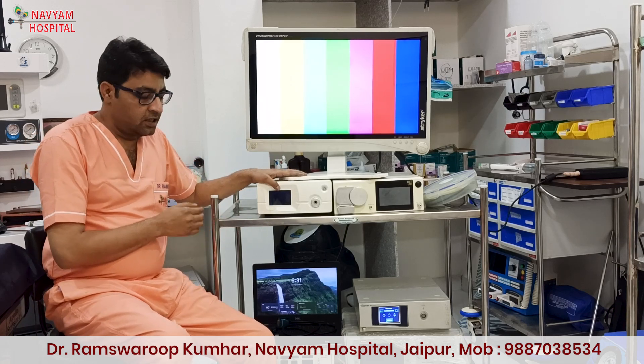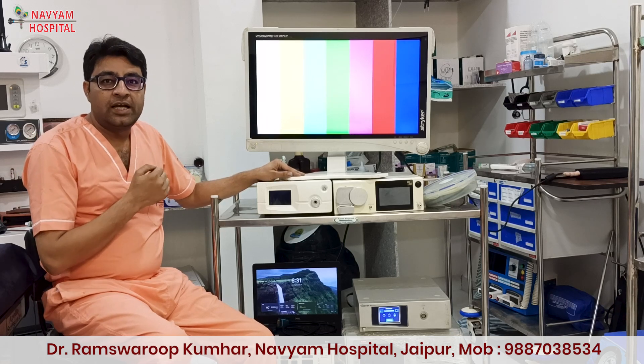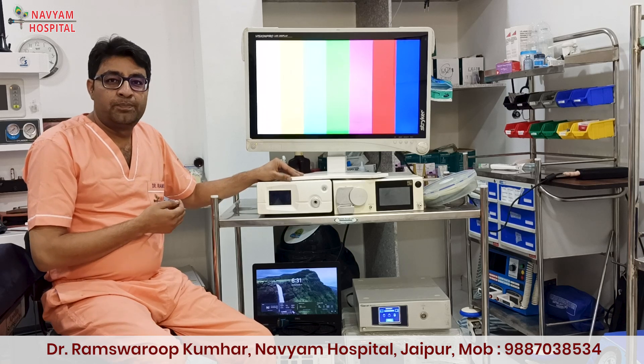So this is the basic setup. You can start with 10 lakh rupees, and you can upgrade according to time, your expertise, and your purchasing power.